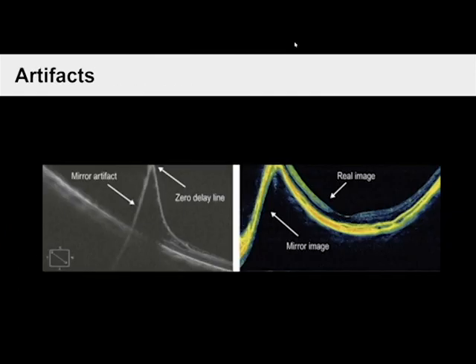Artifacts in OCT can mostly be attributed to eye movements. Operator-related artifacts show degraded images due to poor focus. Two artifacts in OCT which can lead to misdiagnosis are red disease and green disease. In red disease, it is common to see red areas in the results of a reliable OCT scan with no disease. This could mislead doctors and lead to unnecessary treatment. In green disease, software interprets actual glaucomatous damage as normal, showing a false negative diagnosis.